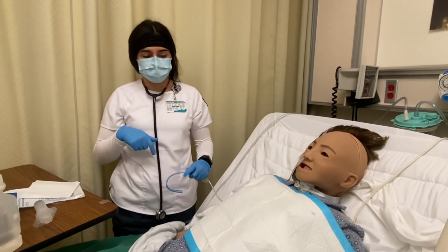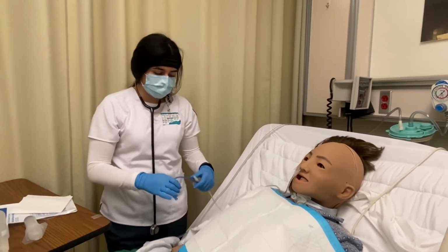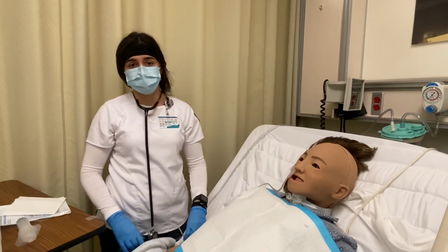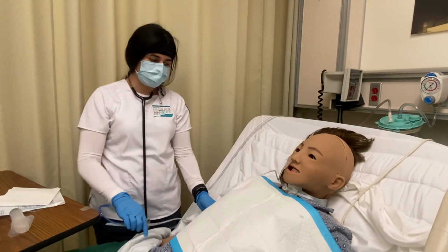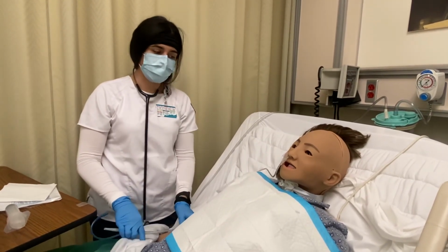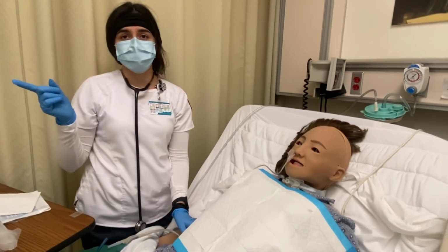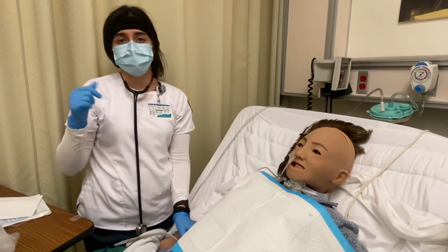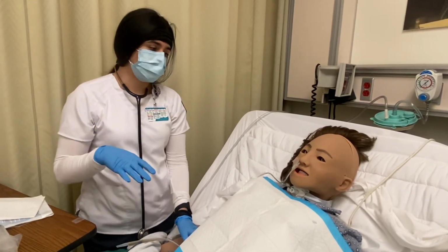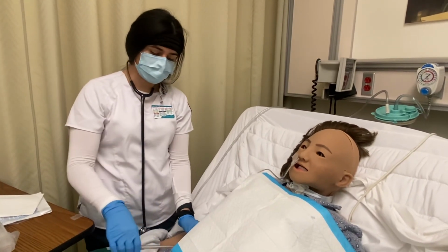After the patient comes back from chest X-ray, I would put this close to them, tie or tape it close to them, so that things are not moving around. When I send them to chest X-ray, I would document my length and how everything went. They come back, I secure it.